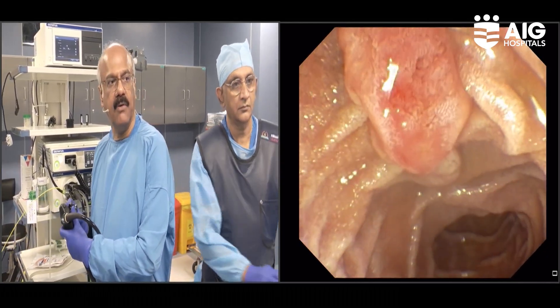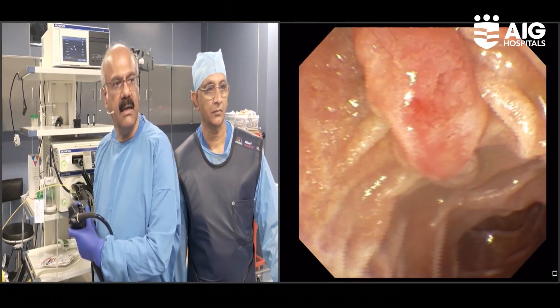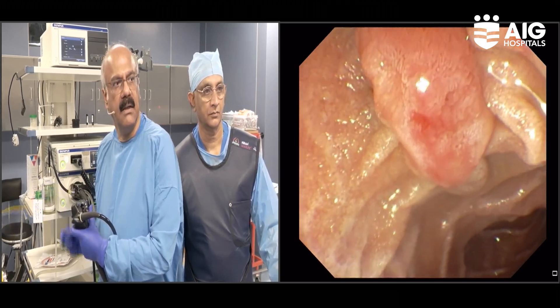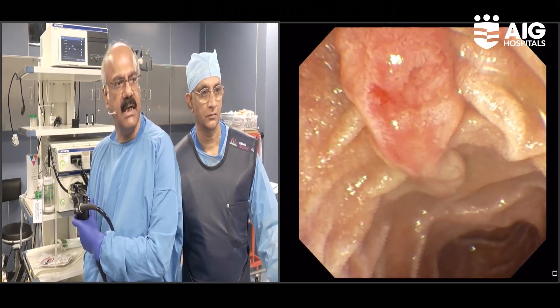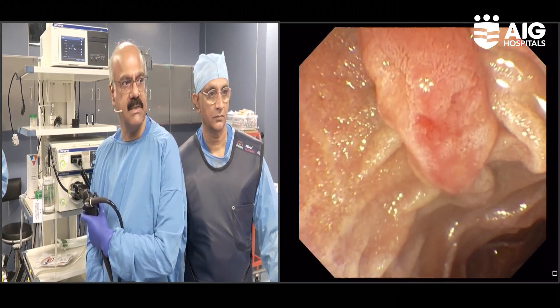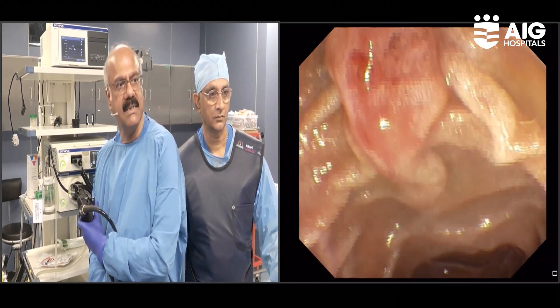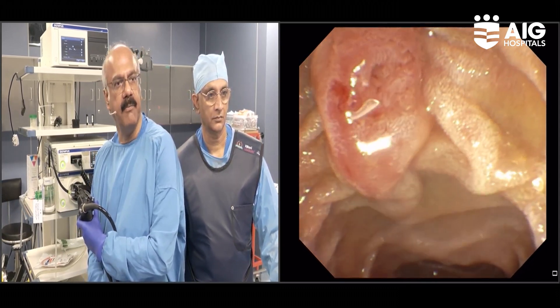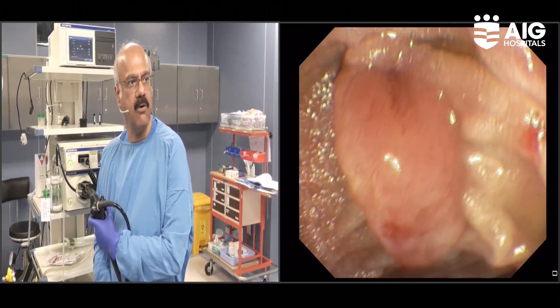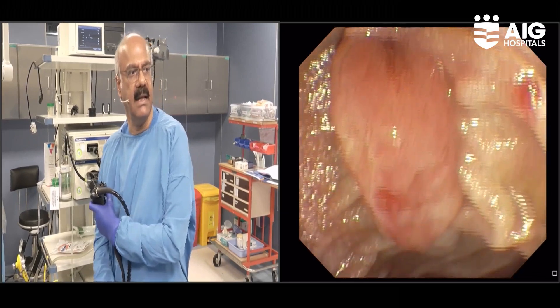I'm now down with a side-viewing endoscope, and you can see very clearly that the papilla looks abnormal. Unfortunately, you can't see any specific characterization to say what this abnormality is, but I can see the papillary opening down here, and above there's another small fistula-like opening going into probably the bile duct, because I can see bile there.